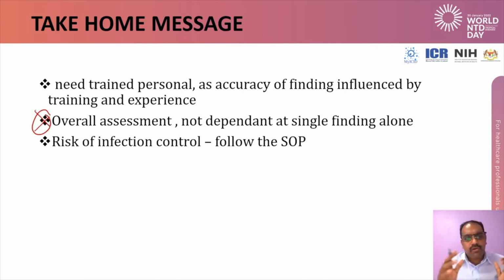You should take an overall assessment, not be fully dependent on a single finding alone. That means IVC scan or LV scan alone is not a gold standard for us to fluid resuscitate. Fluid resuscitation or management is based on a few parameters: clinical findings, your clinical examination, all the laboratory findings, vital sign findings, plus your echo findings.